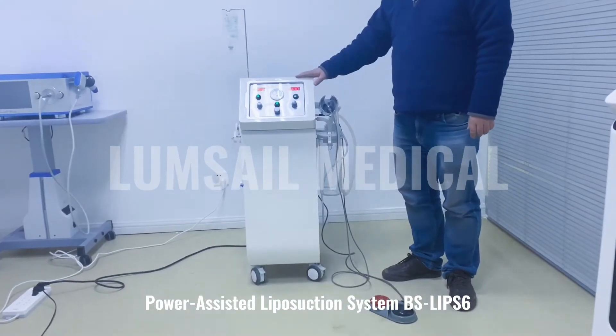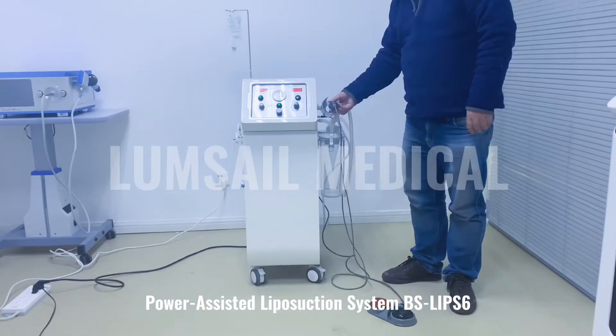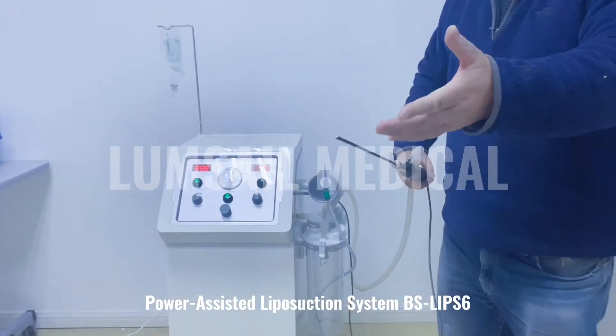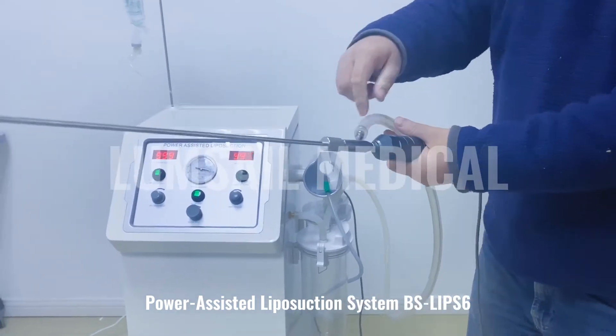This machine provides three functions. The first function is the electric vibrating headpiece. With this headpiece, it can speed up the liposuction procedure and it can suck at the same time.